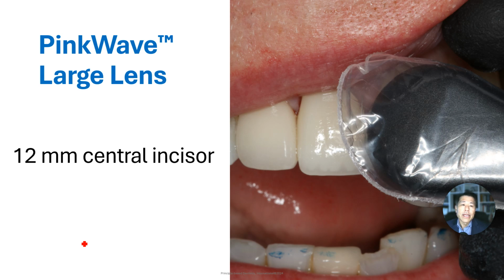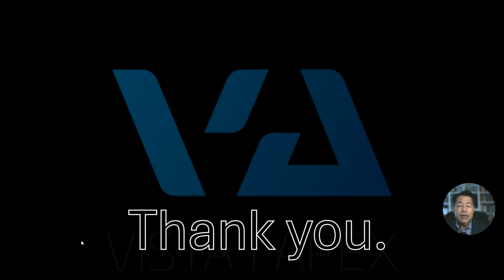Now this is just showing how the week before I was cementing and then bonding in crowns on teeth number 8 and 9, and this patient had really, really long centrals, 12 millimeter long centrals. But look at that pink wave. The pink wave covers the entire facial of that crown. So basically, as I was mentioning before, when I'm curing, I come in and I cure 20 seconds maybe from the facial, 20 seconds from the lingual, and that's going to be adequate. We're not going to have to do a little bit at the cervical, a little bit in the mid-body, a little bit at the incisal edge, like some of you might have to do if you had a smaller head.